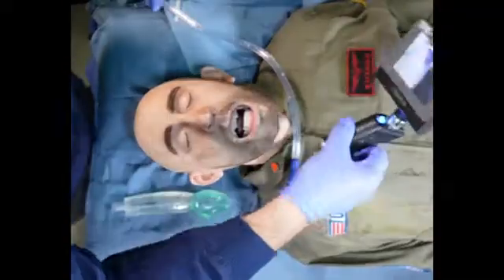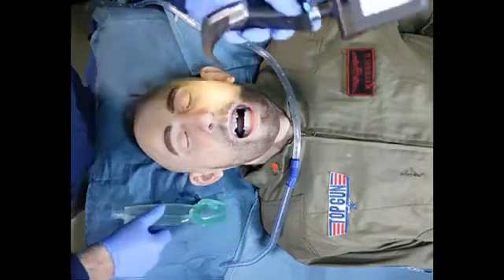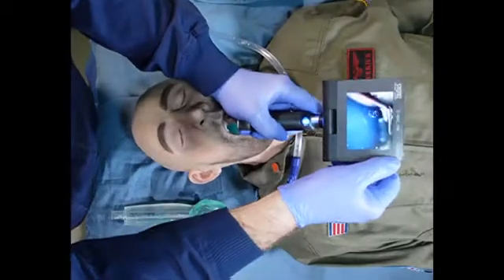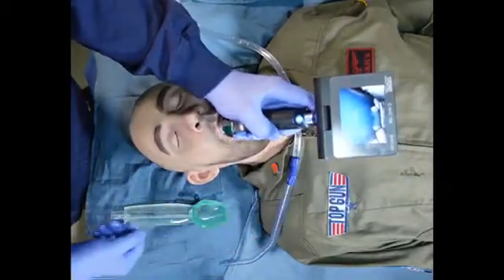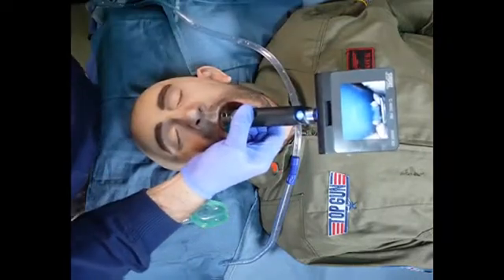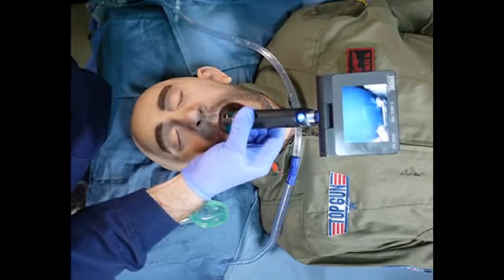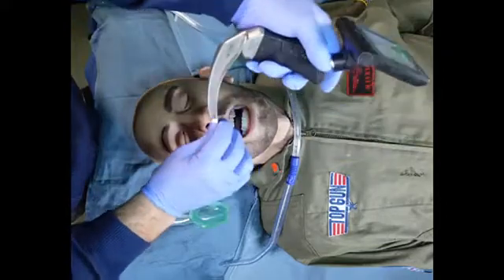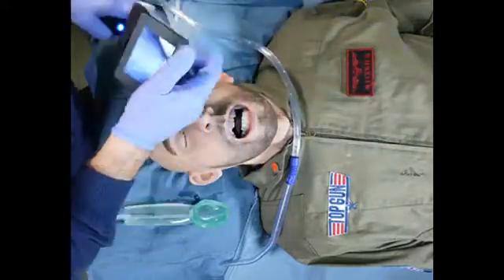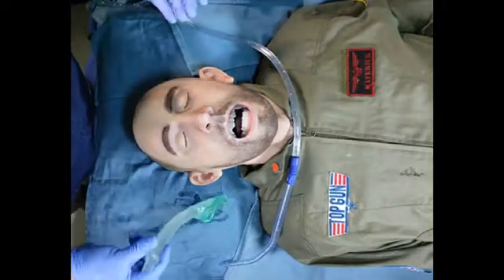To further illustrate the suction-assisted supraglottic airway insertion, I'm going to contaminate the mannequin under direct video guidance here. So we have a contaminated hypopharynx, as we can see. I'm going to put a little bit more airway contaminant in here. Okay. So the patient's going to aspirate at this point if I ventilate the mannequin either with a face mask or with a supraglottic. I'll have to suction this patient before I can adequately place a supraglottic or face mask ventilate.